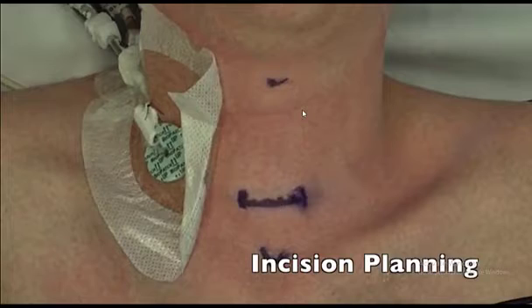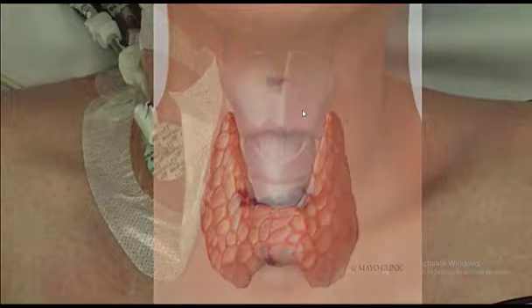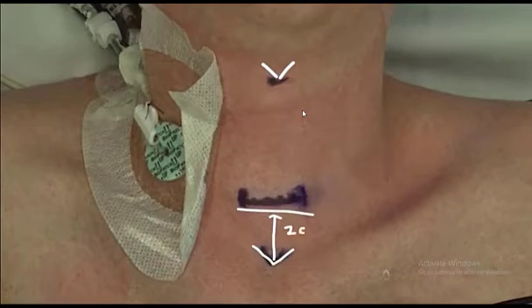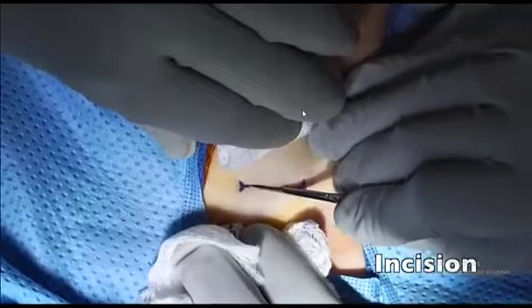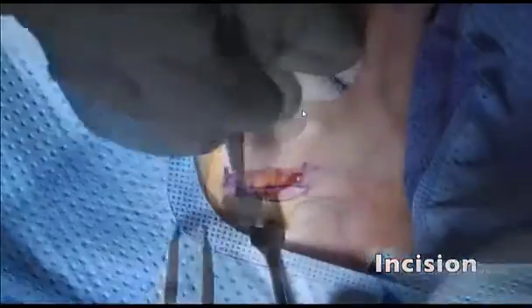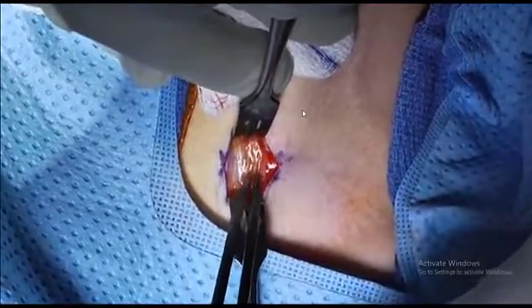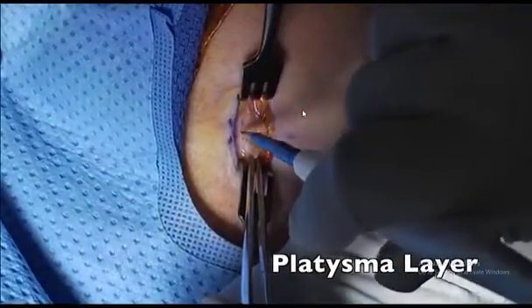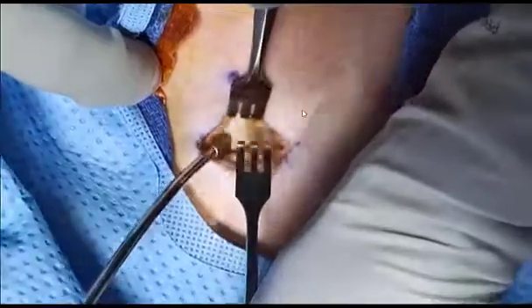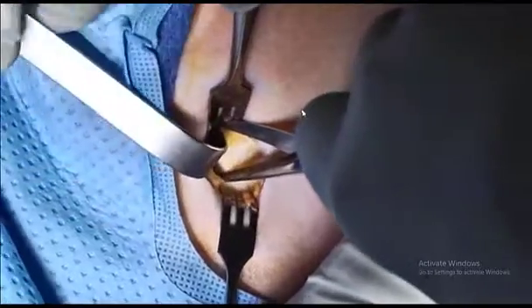So, this is a tracheostomy incision, is tracheotomy. So, this is the procedure na ginagawa natin in the operating room. Here, we will check kung saan tayo magkakaroon ng incision. First, there will be an incision, and then it will be open. So, the instrument that they are using here, kailangan po natin ng cautery to prevent, of course, bleeding. Here, as you can see, ito yung fascia. So, it is being divided.